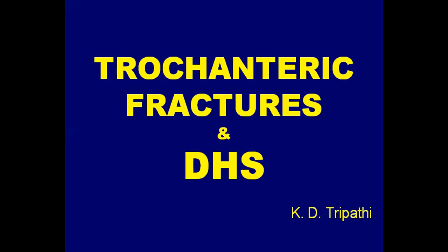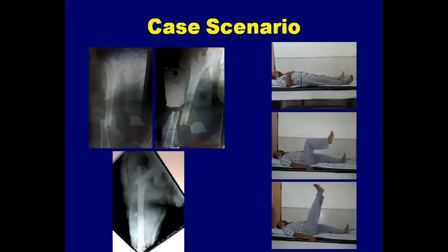Here we are going to discuss the role of dynamic hip screw in trochanteric fractures. In this era of PFN in trochanteric fractures, whether DHS is totally abandoned or it is still relevant for the orthopedic fraternity. Let me start with few case examples.